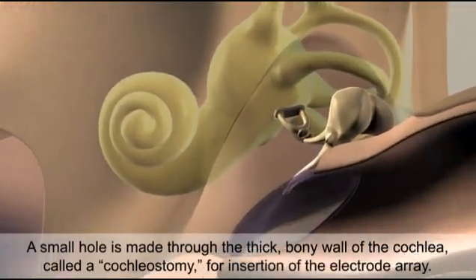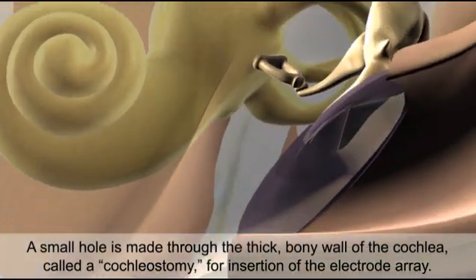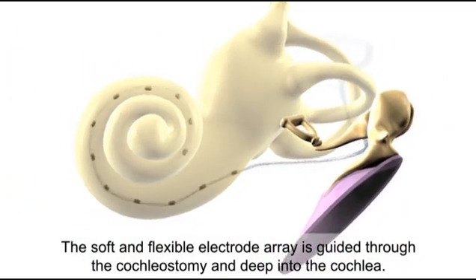A small hole is made through the thick bony wall of the cochlea, called a cochleostomy, for insertion of the electrode array. The soft and flexible electrode array is guided through the cochleostomy and deep into the cochlea.